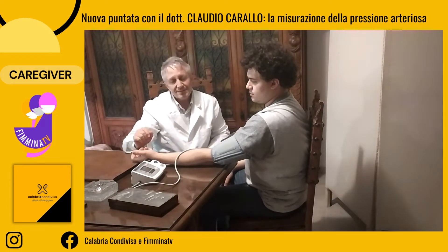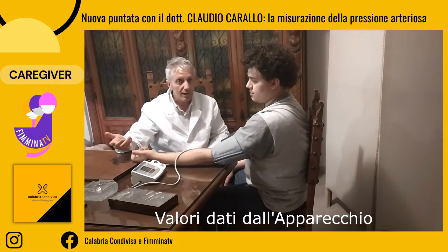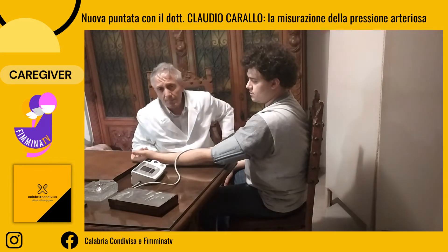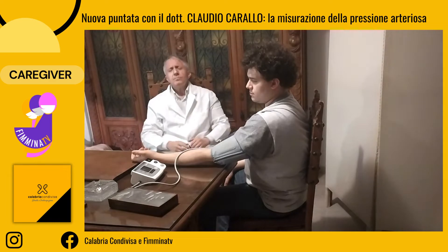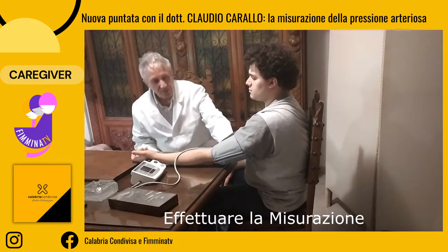A questo punto potete effettuare la misurazione. L'apparecchio farà da solo: vi darà un messaggio di errore, o vi darà un messaggio di pressione, con di solito anche una frequenza cardiaca. Alcuni apparecchi danno anche un valore abbastanza attendibile della tipologia di ritmo cardiaco, individuando delle aritmie come la fibrillazione atriale, suggerendo quindi di rivolgersi al proprio medico.